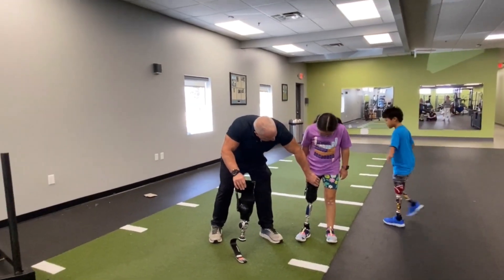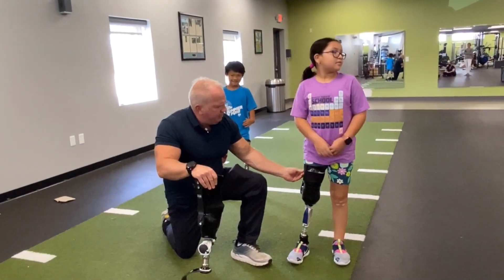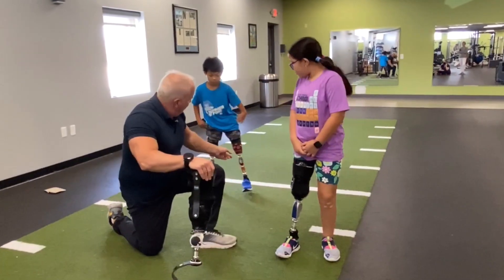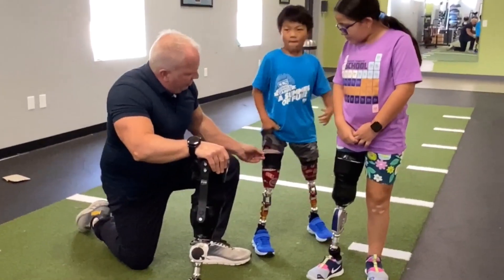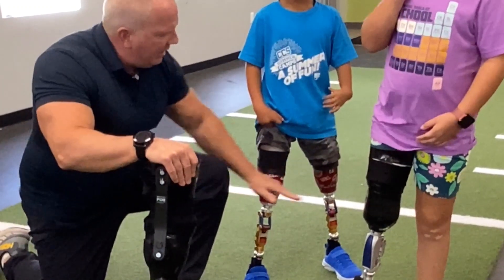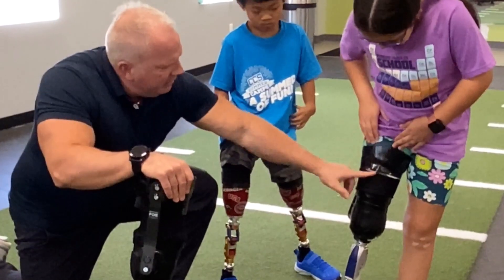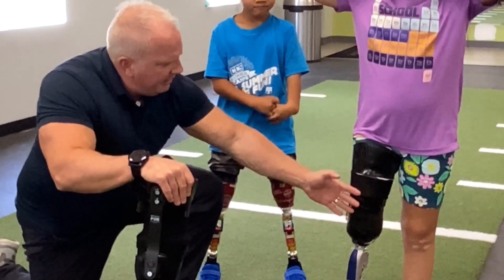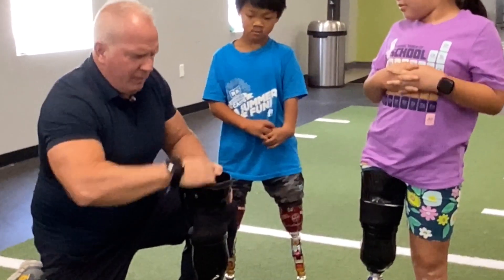What this allows is the muscles here can continue to fire. We're actually suspending the leg with a sleeve, just like here — Charlie's is the same way. This is attaching to the liner; the sleeve is just like a below-the-knee amputee. We're utilizing the weight-bearing characteristics. We're also able to increase the size in the front part of the distal articulation, because if we didn't do that, the tissue would not be able to fire and it would cramp the tissue.